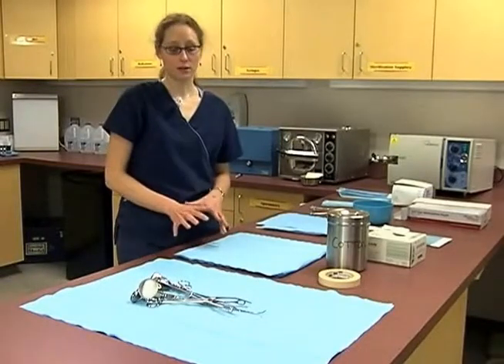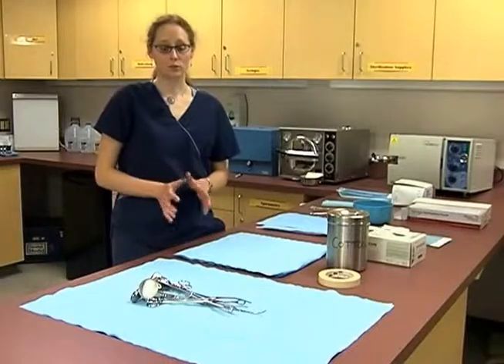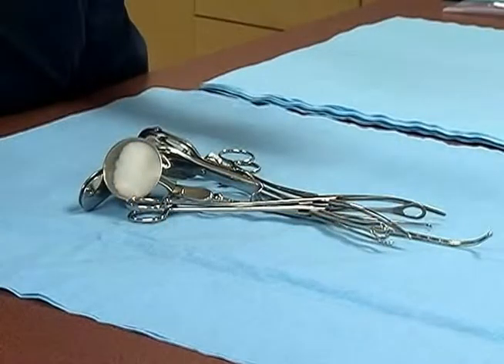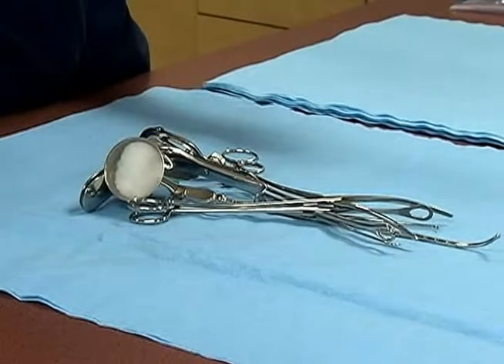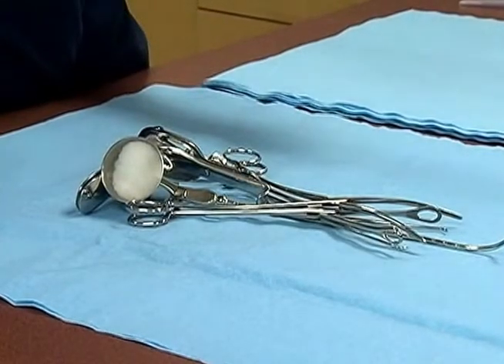Before we get started with the autoclave, we need to make sure that we have all the necessary supplies. Of course, we're going to need the surgical tools. Before we can wrap them, they need to have been sanitized with a disinfectant, rinsed, and then dried off. They must be completely dry before going into the autoclave, because we can't get any of the paper wet and we cannot be introducing any excess moisture to the autoclave.